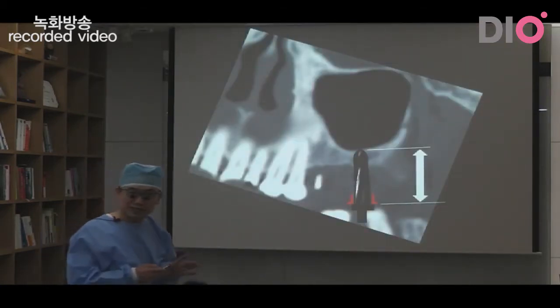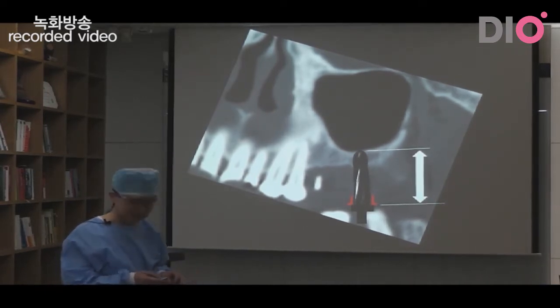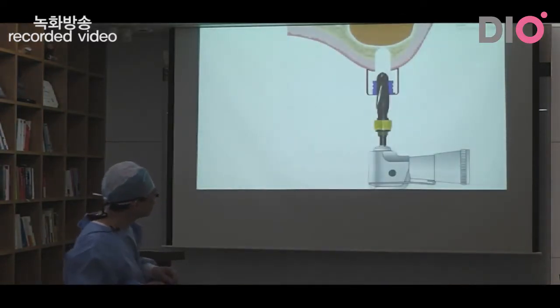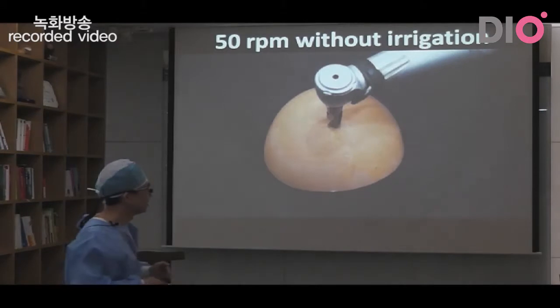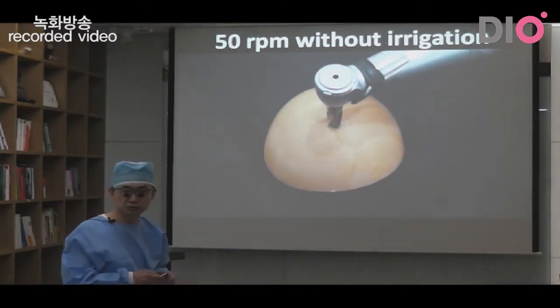The drilling depth was already determined using the cone beam CT scan image. I'm going to drill just below the sinus floor. And then I'm going to use this low speed drilling without irrigation. The speed is about 50 RPM.